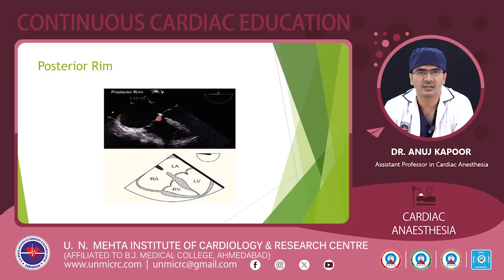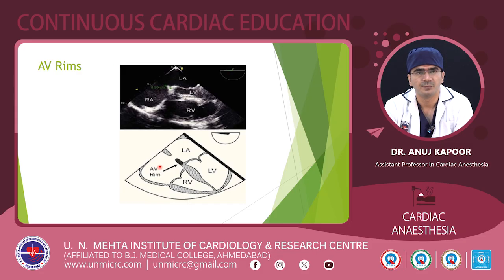The first is the posterior rim. This can be seen in a mid-esophageal 4-chamber view. On the upper side, we don't have to angle it much. We can see it in a 4-chamber view, and we'll have to measure it to get the size of the rim. Ideally, the rim size of all should be around 5 mm. That will ensure a good attachment of the device that we will deploy. So, measuring the posterior rim in a mid-esophageal 4-chamber view.